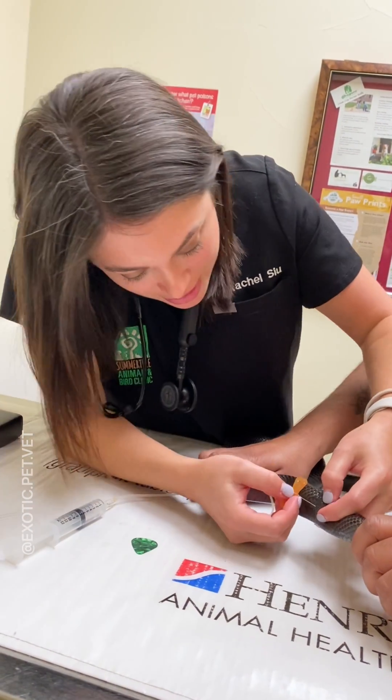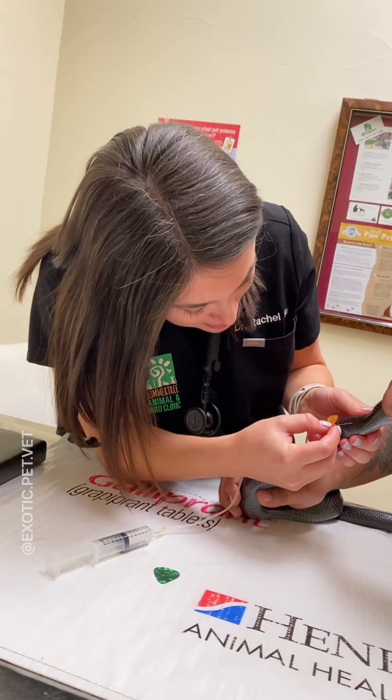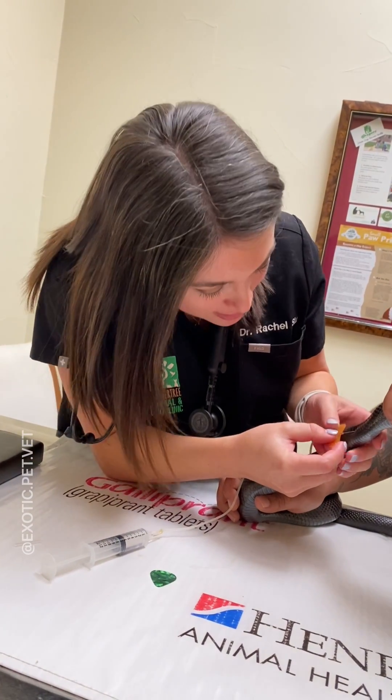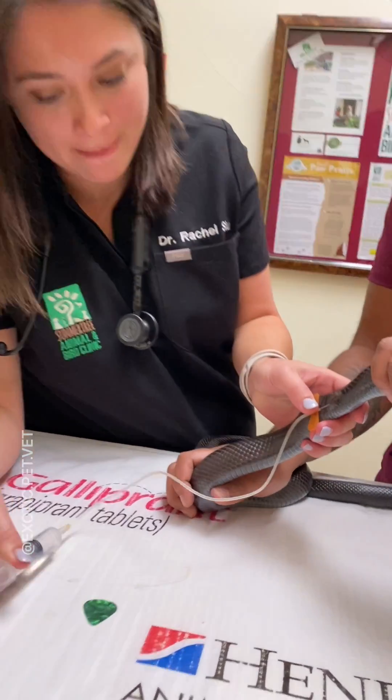When inserting the needle I try to find a piece of loose skin on the side of the body. I then direct the needle in between the scales at a shallow angle, hold on to the tabs with my left hand, and give the injection with my right.